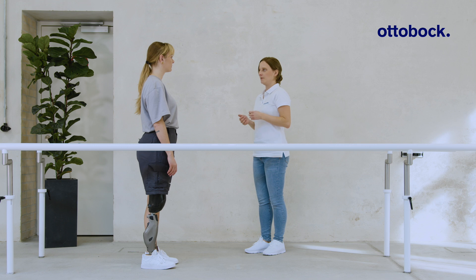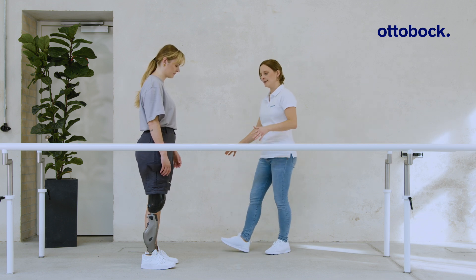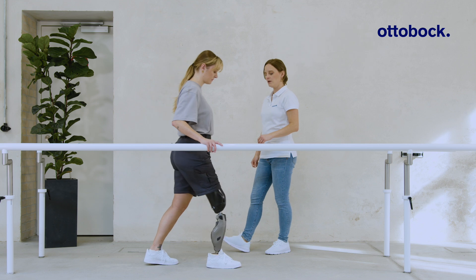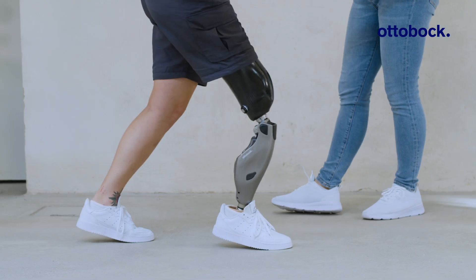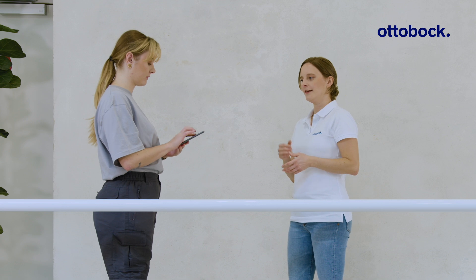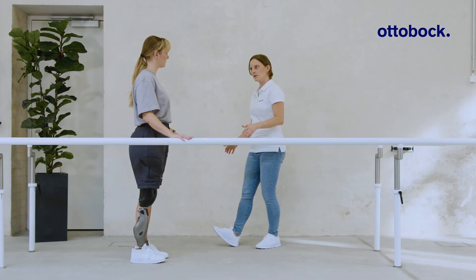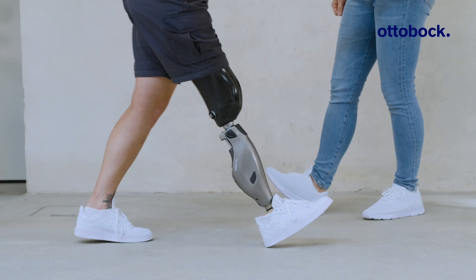For users lacking residual limb control and overall stability, it is helpful to lock stance phase at the beginning of rehabilitation. Both the user and the CPO can set this on the app. Please note that this prevents the knee joint from flexing under load.